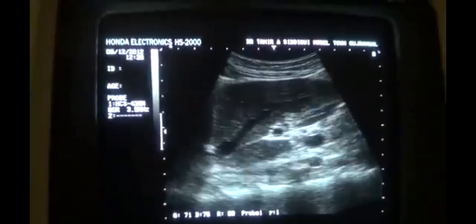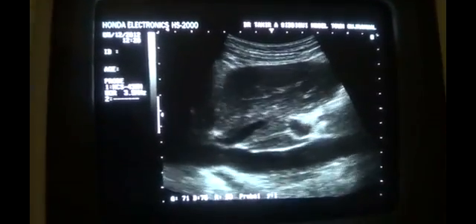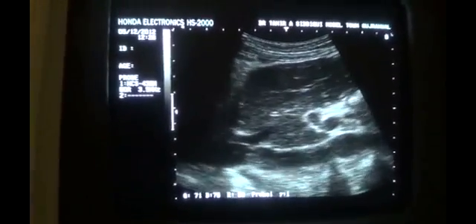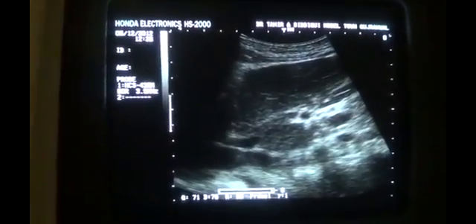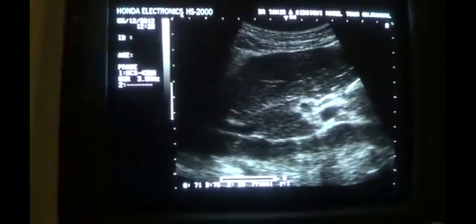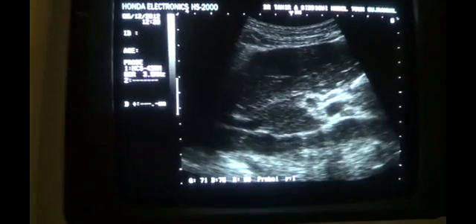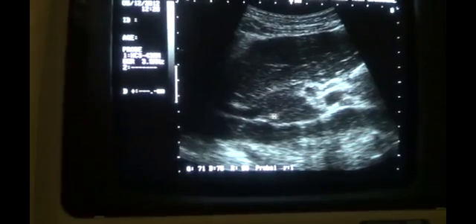And in longitudinal section, when I come to the liver and give an appropriate sweep, here you are: the same area that we were labeling as a lymph node now gives the appearance of being the caudate lobe of the liver rather than a lymph node. As you know, the caudate lobe of the liver is bounded anteriorly by the ligamentum venosum and posteriorly by the IVC. In this longitudinal section, the area between these two structures is segment 1 of the liver.